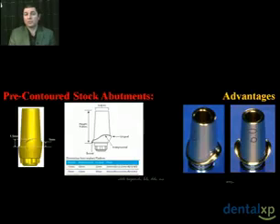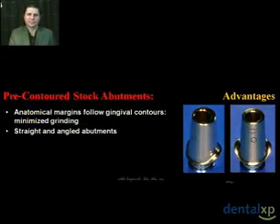The facial margin is closer to the implant platform, which is where it needs to be in order to hide the restorative margin in the aesthetic zone. However, the lingual margin is much higher, where the aesthetic zone is not an issue, and however, accessibility to excess cement is. And if you look interproximally, there's also a rise and fall, simulating the interproximal rise and fall of the soft tissue. So this area supports the soft tissue interproximally, providing support and providing a biocompatible surface for the soft tissue.